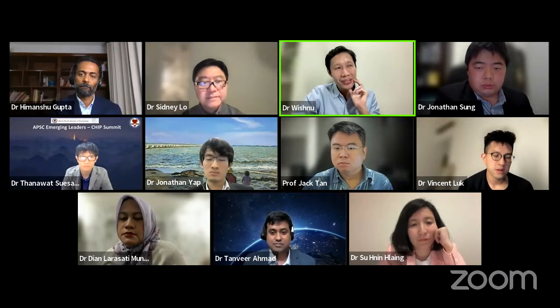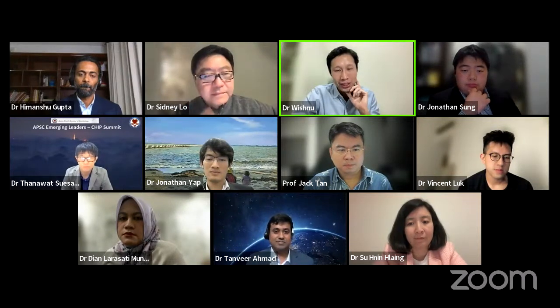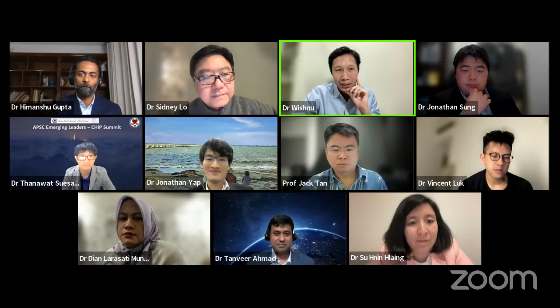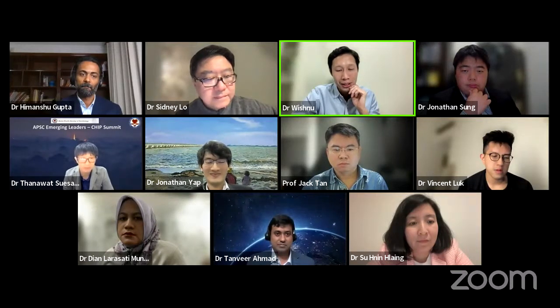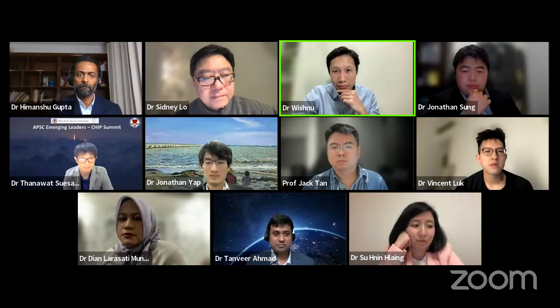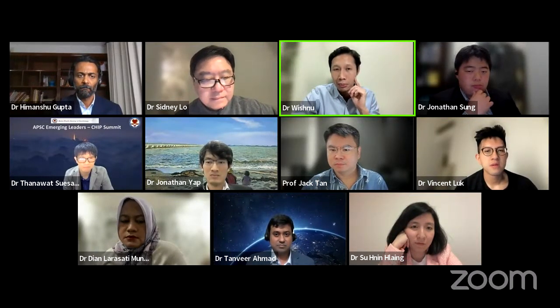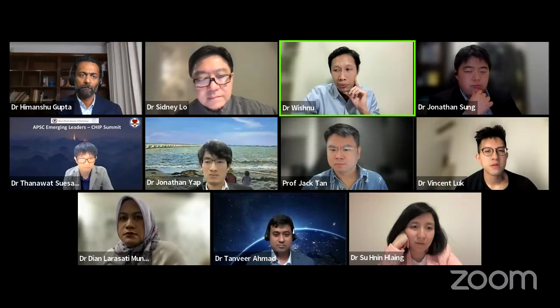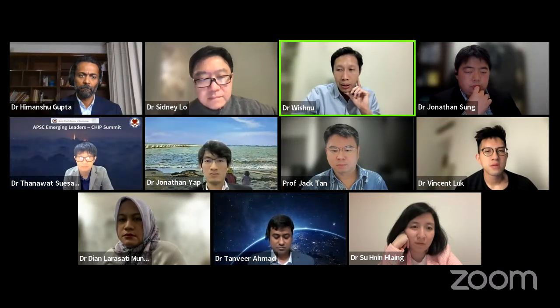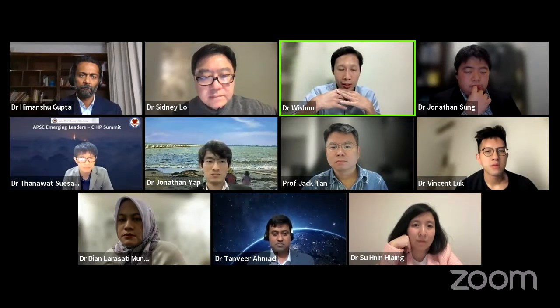It's quite interesting that we are always talking about the same thing in burst situations. It's always nodular and it's always sharp. So I'd like to share some experience, because probably unlike others, I have more experience with orbital atherectomy than Rota. Orbital atherectomy has been in Indonesia for a little more than 2 years, and I had the privilege to do around 5 to 10 cases. In my opinion, it's quite good to tackle nodular calcification.